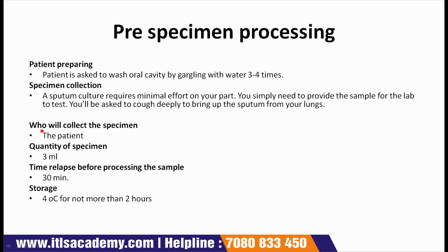Next comes a few questions like who will collect the specimen. So, in the case of sputum culture, the patient will collect the specimen, while in most of the cases, the physician collects the specimen.